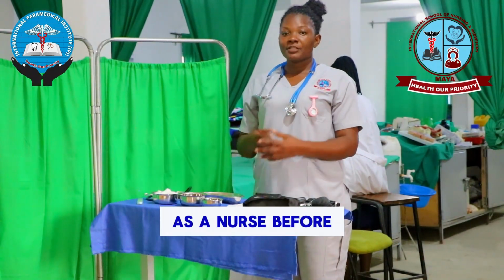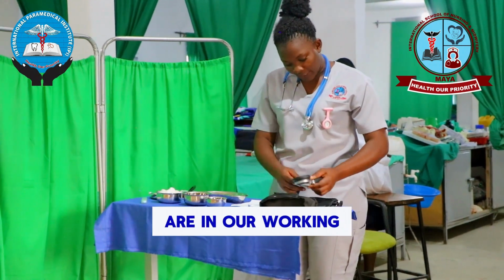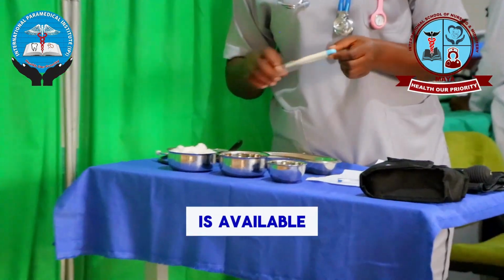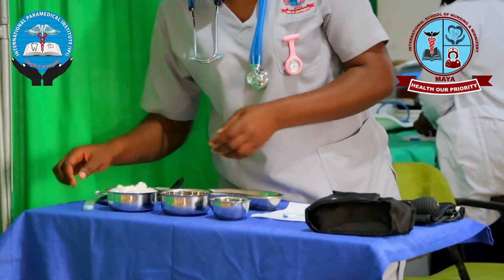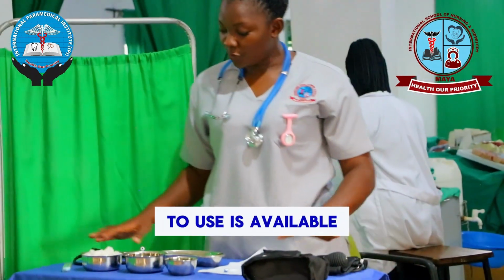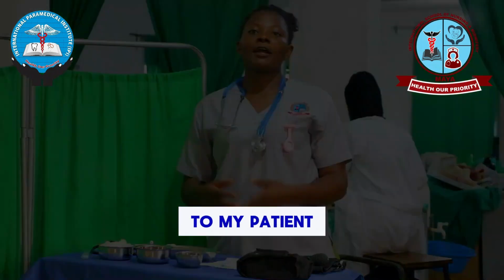As a nurse, before you start the procedure, you must prepare the equipment that you're going to use. Like now, checking if my equipments are in a working condition before I start the procedure, and ensuring that everything that I'm going to use is available. So everything I'm going to use is available here. Now I'm going to go and create a report to my patient and I carry out the procedure.